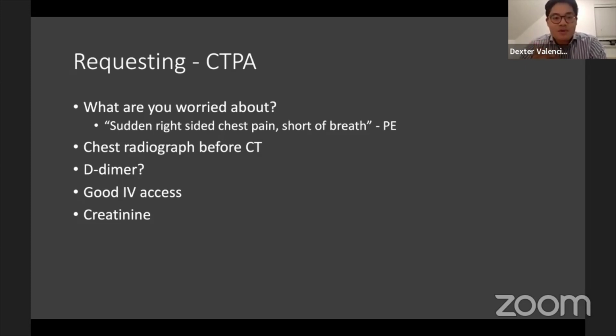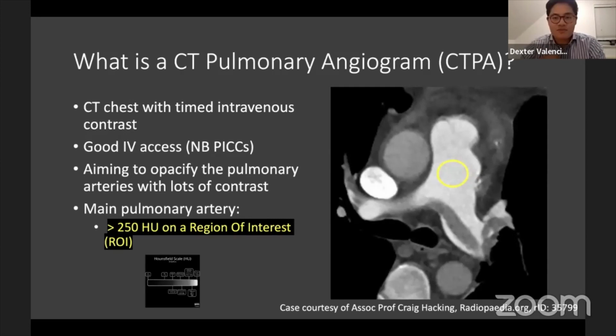And when you request a CTPA, just make sure the patient has good IV access, I'll come on to why, and make sure you're happy to give contrast with their creatinine level. Make sure they haven't got significant kidney failure before we start giving them contrast.